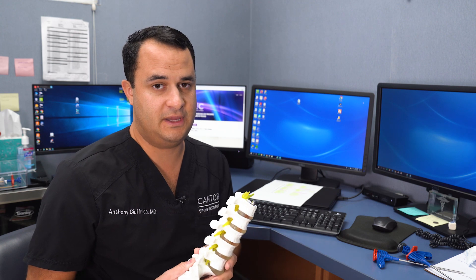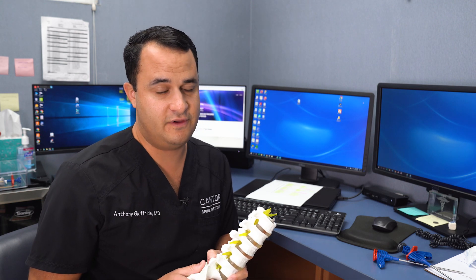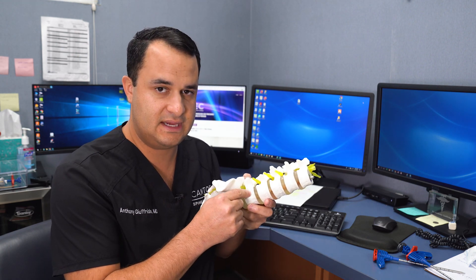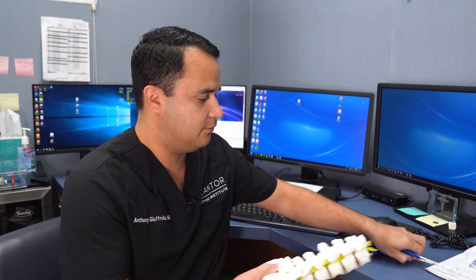But when that doesn't work for the patient, we go to the next step, which is basivertebral nerve ablation with the Intracept system. So it's a very new procedure. We go down through the pedicle, get into where the nerve lies inside the bone, inside the vertebral body, and we're able to kill that nerve with some heat. It's very simple.